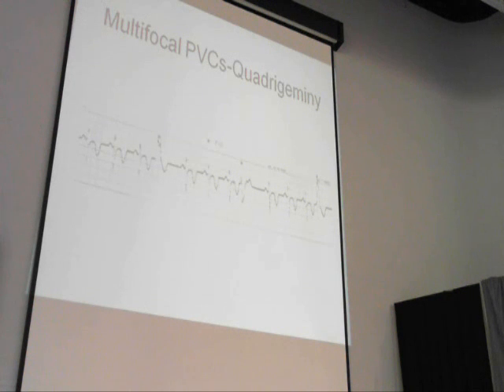If our PVC is going upward, then the T wave is going downward. There's an inverse relationship between the actual PVC and the T wave.